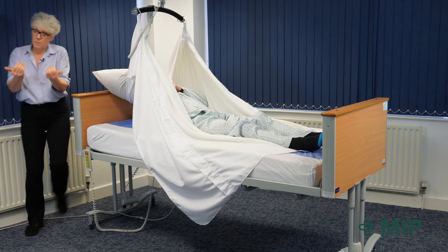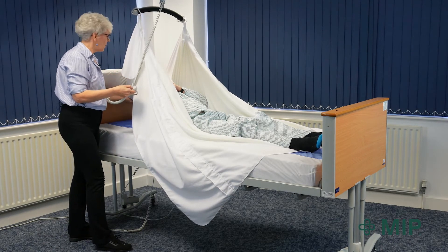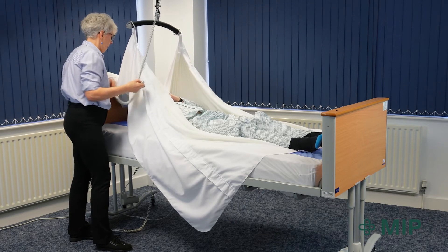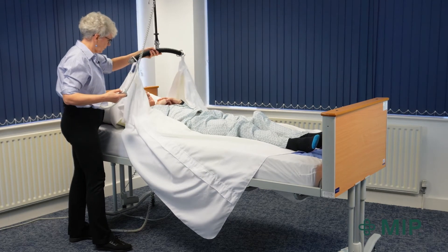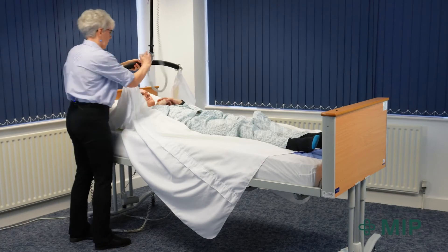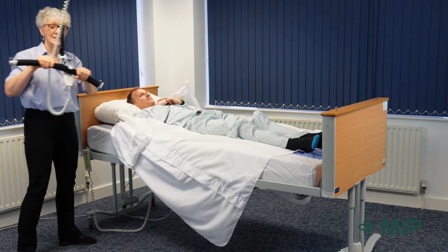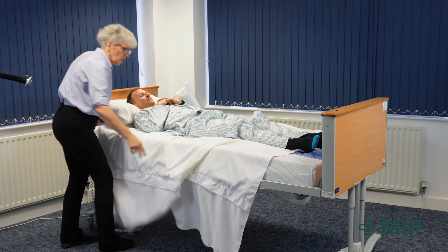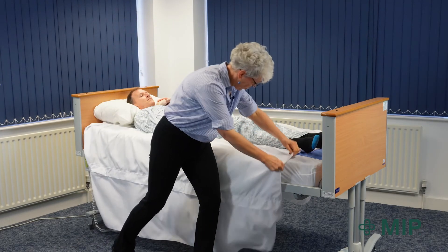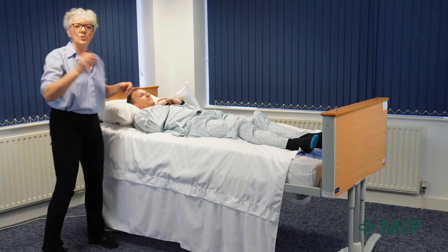Once I'm happy with that position and I've brought him up the bed, I'm going to lower the hoist down — there we go. Unhook everything and move the hoist out of the way, and then as before make sure that the top sheet creases have come out and then tuck it in to lock it.